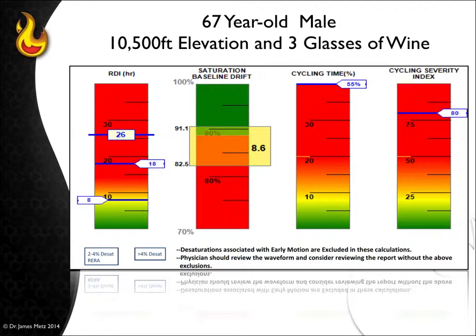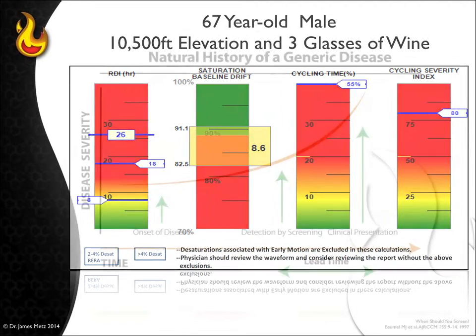So you must know what has happened each night. I really do recommend that you record 3 nights in a row rather than just one night, because if you're dealing with someone who drinks, they may not drink one night, they may not drink the second night, but almost for sure they'll drink the third night because they can't stand it. And you'll catch it and you'll see what the difference is. It'll let you see why your oximeters or why your appliance is not working sometimes.